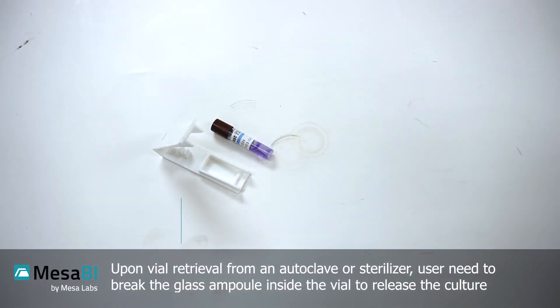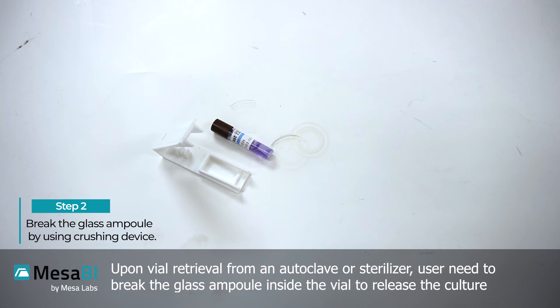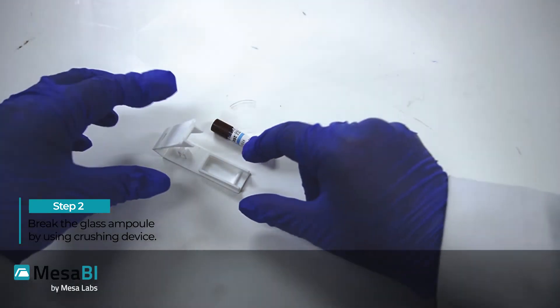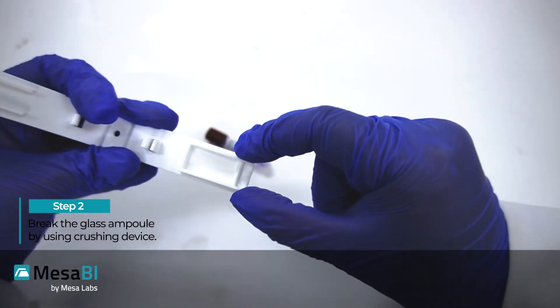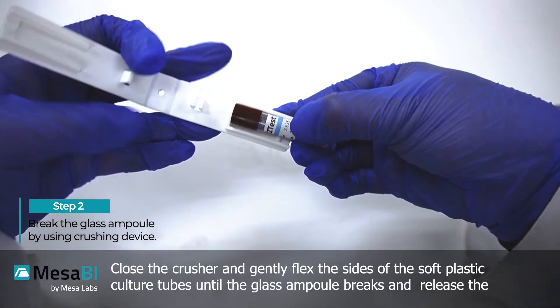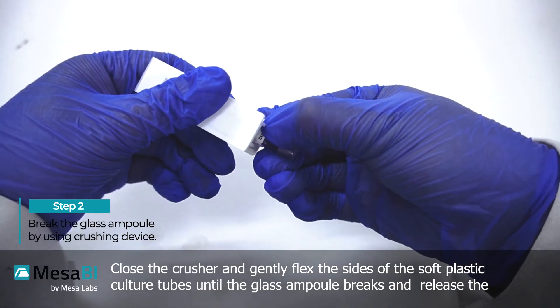Upon vial retrieval from an autoclave or sterilizer, the user needs to break the glass ampule inside the vial to release the culture medium. Place the Easy Test biological indicator vial inside the crusher, close the crusher, and gently flex the sides of the soft plastic culture tube.